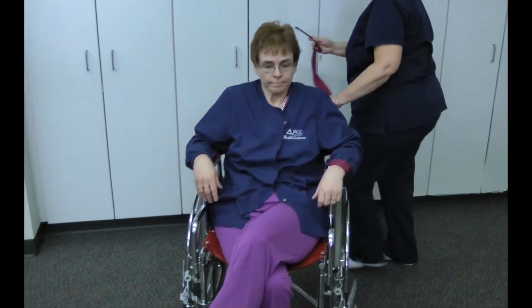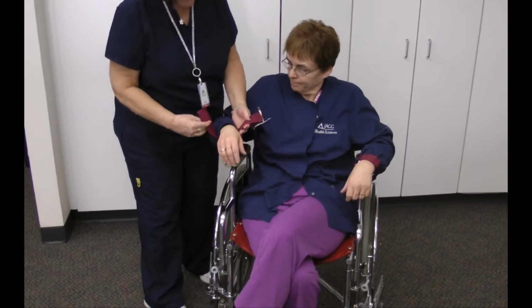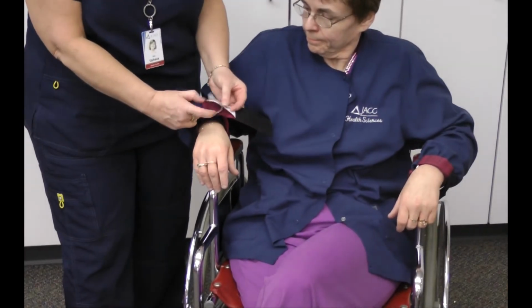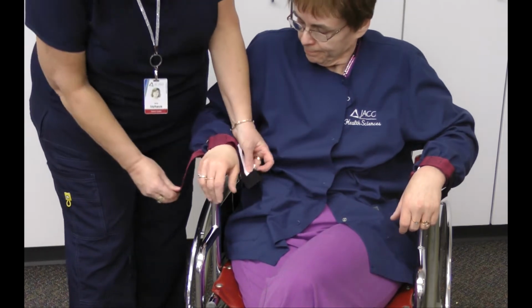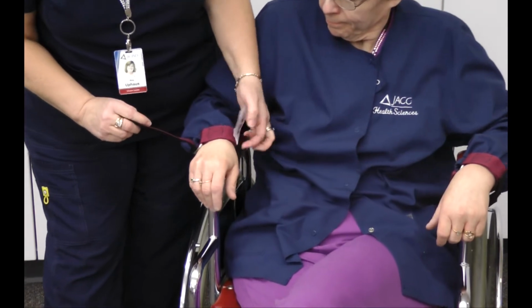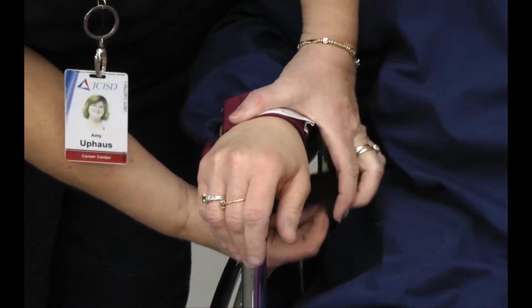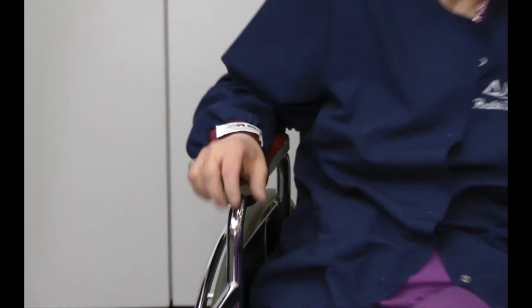So Melissa, I'm just going to pretend, put that one on. I'm going to come around here. I'm going to apply this one. It goes through the ring. And then you're just making sure that the stickiness of the Velcro is sticking. Okay, Melissa, go ahead and try to lift your arms up. You're pretty restrained, aren't you?